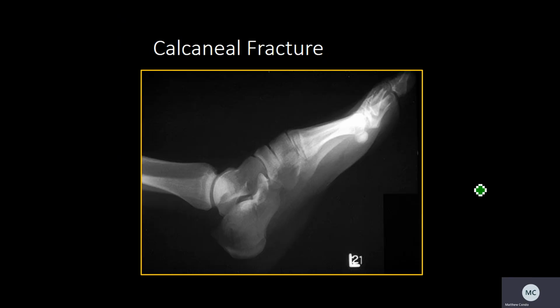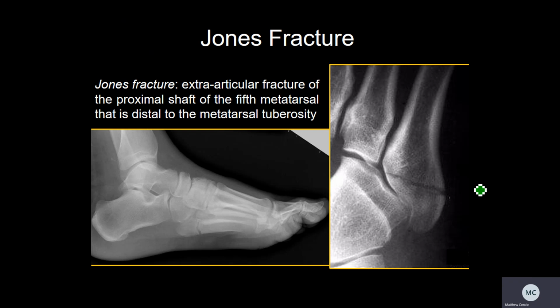This is another good picture of a calcaneal fracture. If you're having difficulty seeing it, the calcaneal fracture is right there and pretty evident. These are Jones fractures, right?